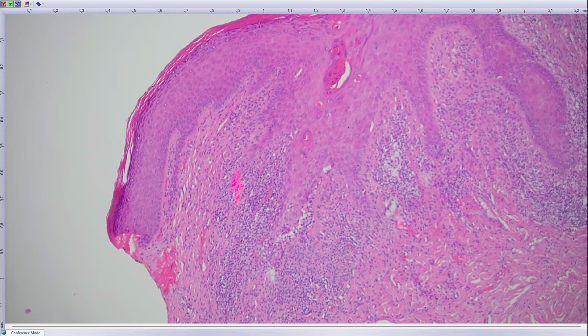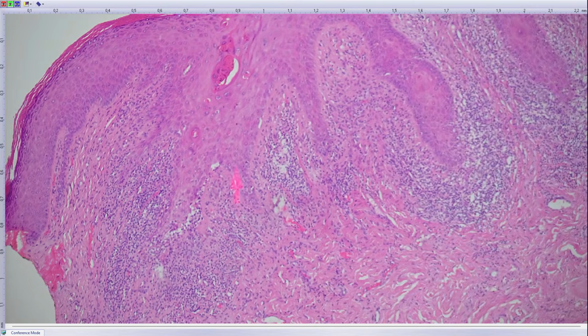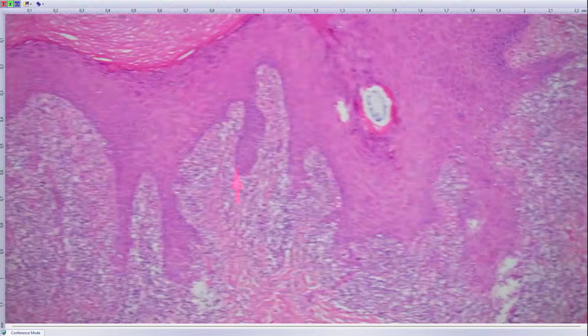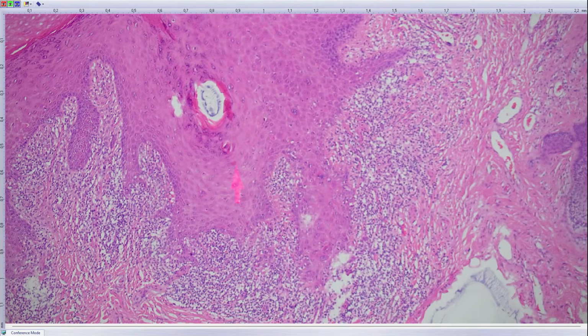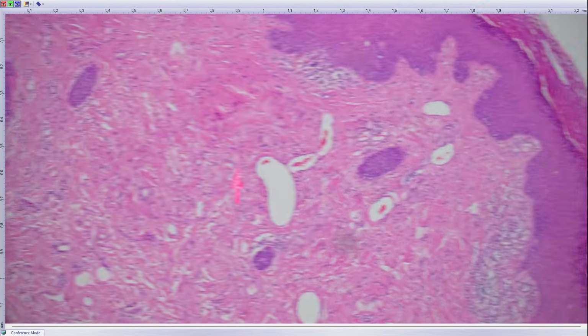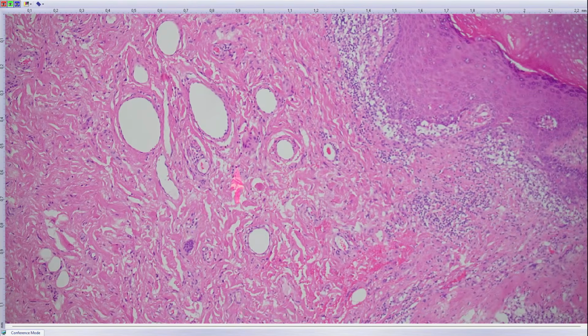it's the same pink-like change like in the cervix, it's already microinvasive carcinoma. It is our experience that these very incipient squamous cell carcinomas do not reach lymphatics, and we never saw a case that would metastasize being developed as that. Just what is imperative is that lichen sclerosus is very often a multifocal lesion, and there may be another focus of lichen sclerosus with the same process.